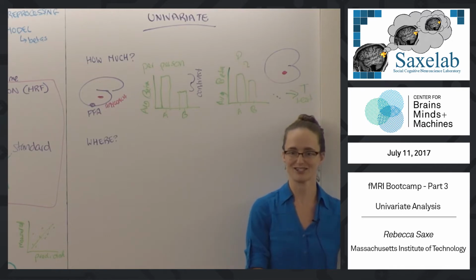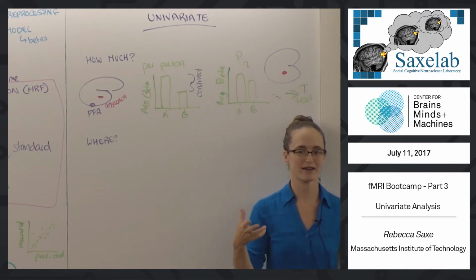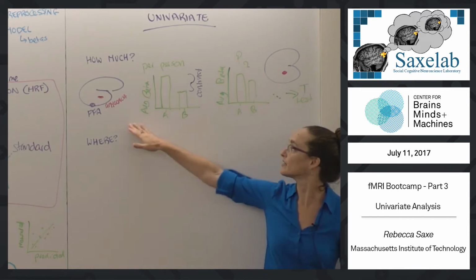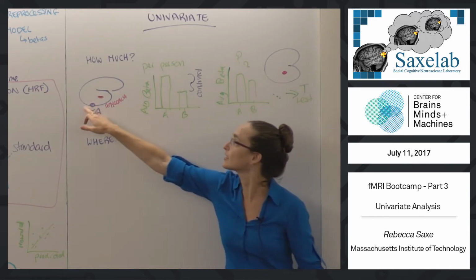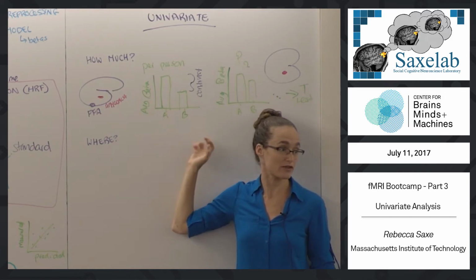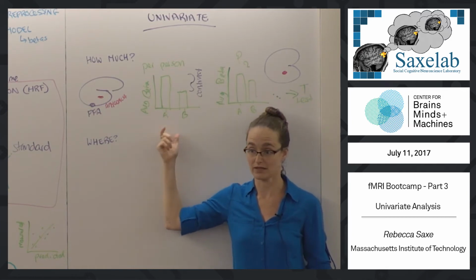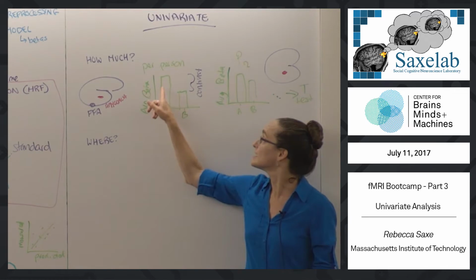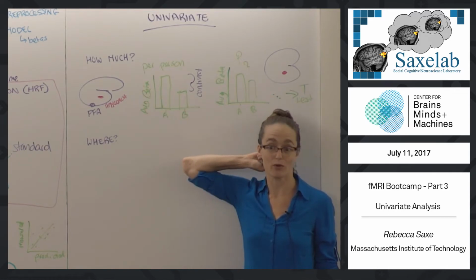I was not planning to talk about it. All I'm planning to tell you about is the concept in the analysis. There the concept is, you know where you're looking, you can average the betas to those responses, and then you can ask whether there's a reliable difference across people in the size and direction of that difference. Another whole interesting controversy, actually, is how big does that difference have to be to be important?